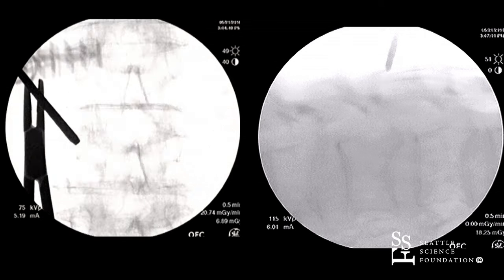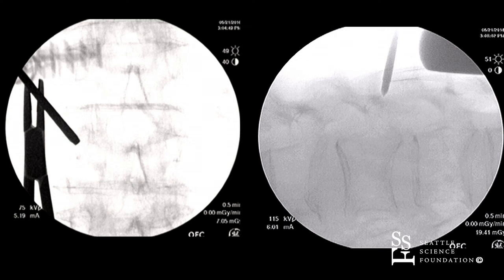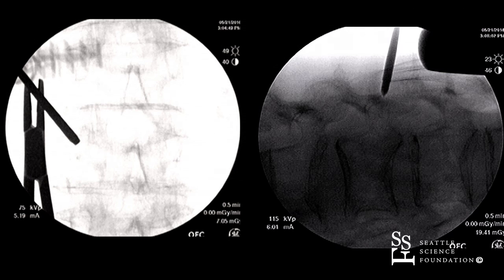What are you aiming for? The middle of the body and a little bit down? Right now I am aiming for the middle of the body. You can see on the lateral, the trajectory is online for the middle portion of the vertebral body. I'm changing the orientation of the needle tip to make sure I get to that portion of the vertebral body. In this instance, both the superior end plate and inferior end plate are affected.